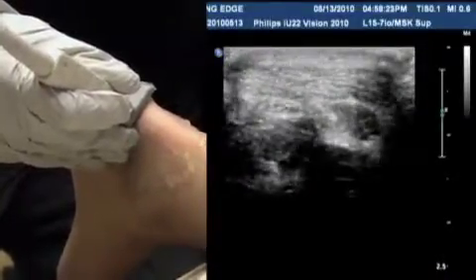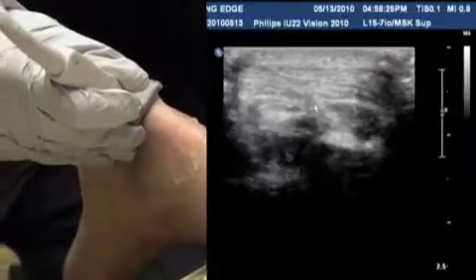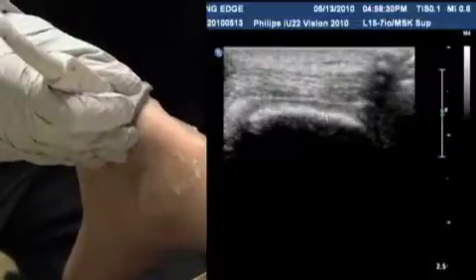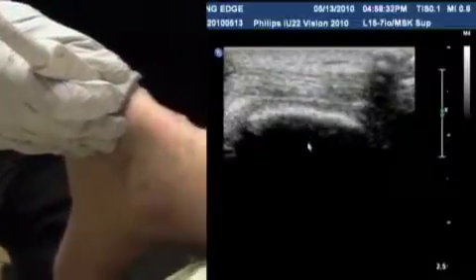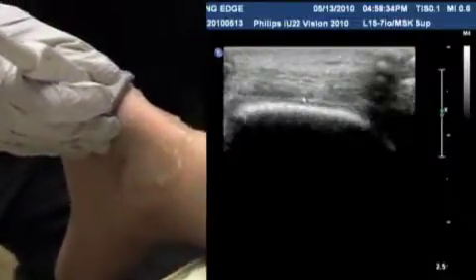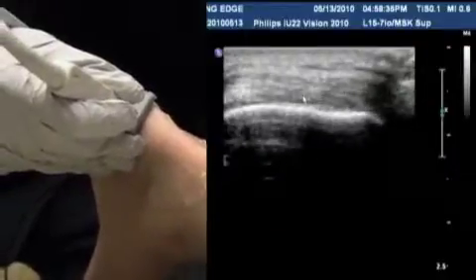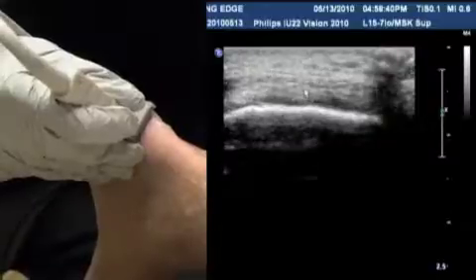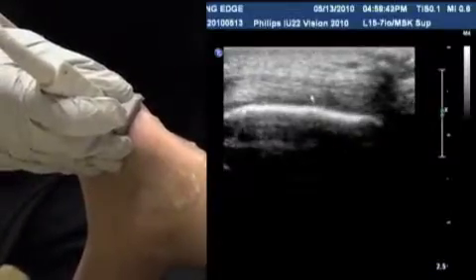And as you come down, there's the tendon, and you will see the calcaneum appear below, right there, which is more echogenic and it shadows. So the tendon is above it, and it's going to come and again insert onto the tendon. What happens as it inserts, same thing happens. Because it's curving down, you lose the 90 degrees.